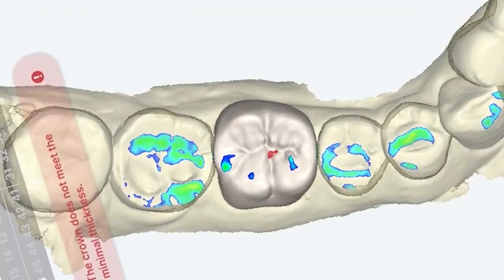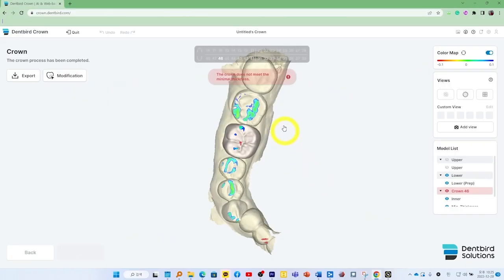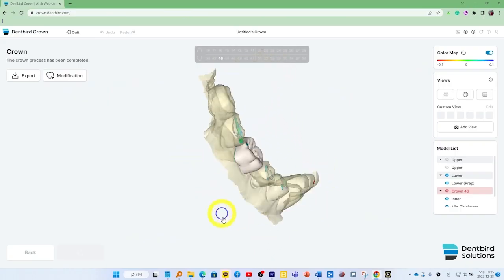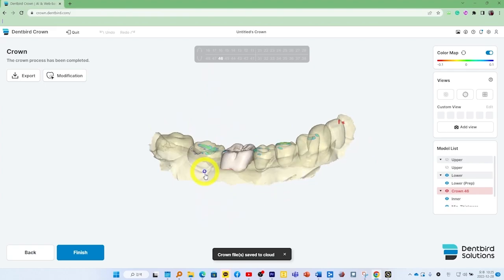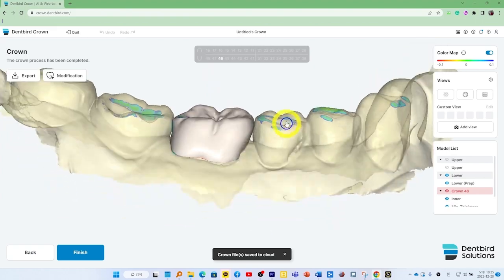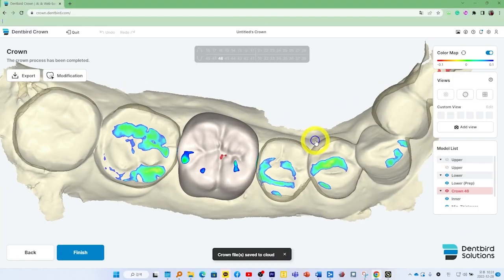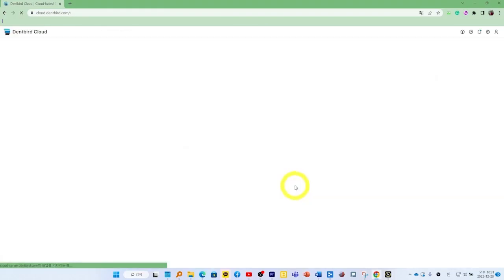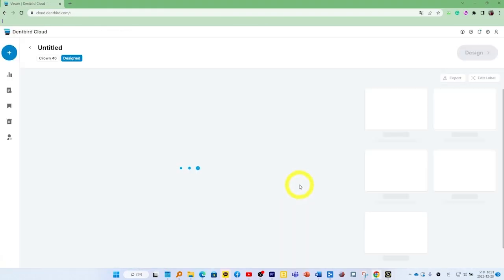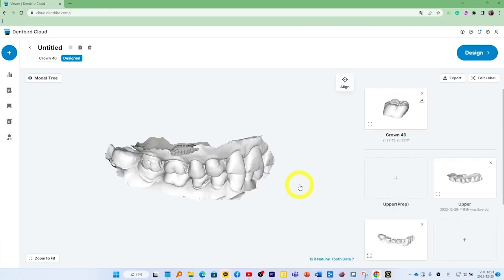Check the crown that has been completed automatically. You can modify the design, but you don't really need to change anything. Let's finish.